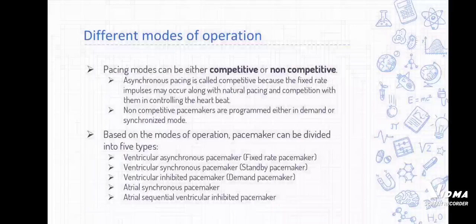Different modes of operation. Pacing modes of the pacemaker can be either competitive or non-competitive. Asynchronous pacing is called competitive because the fixed rate impulses may occur along with natural pacing, and competition with them is controlling the heartbeat. Non-competitive pacemakers are programmed in either demand or synchronized mode.